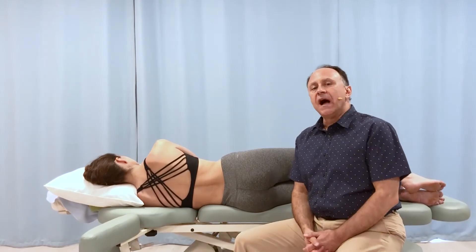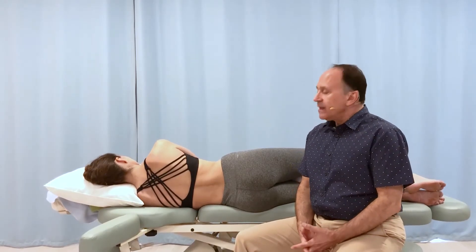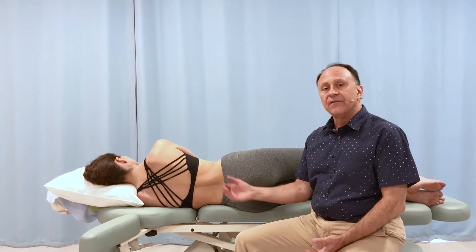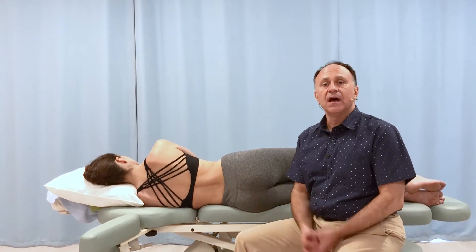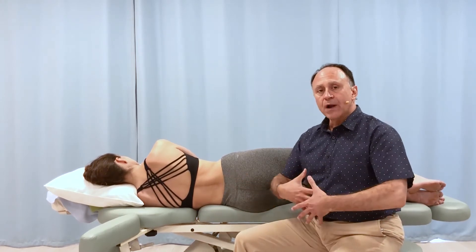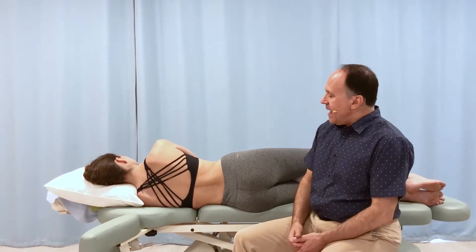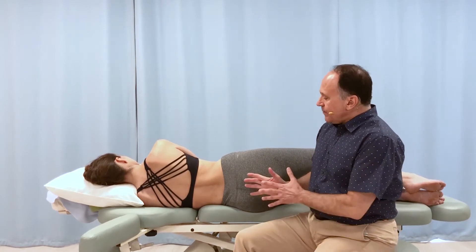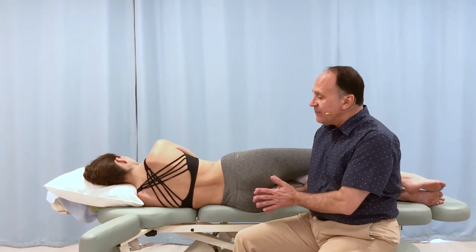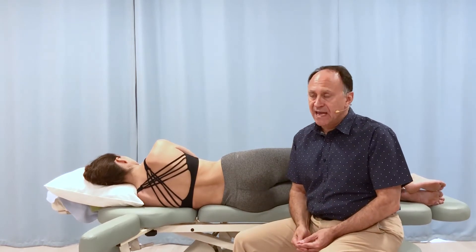In another Digital Compt video, we were looking at how we can use bolsters under the apex of the convexity of a scoliotic curve to try to open up and stretch that scoliotic curve. Now I'd like to point out there's another technique we can use if we have what's called a flexion break table.